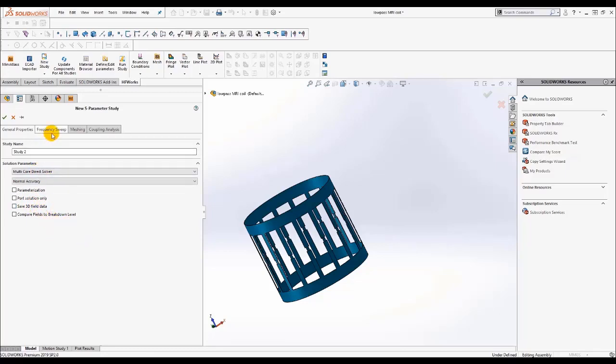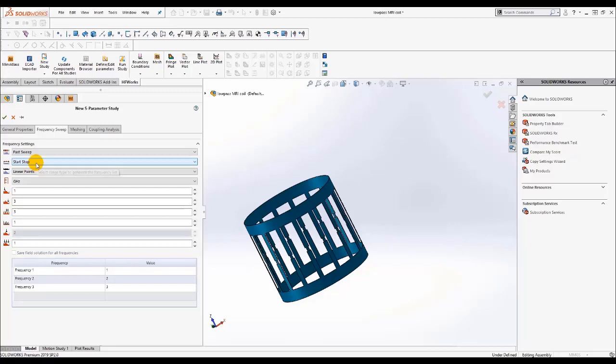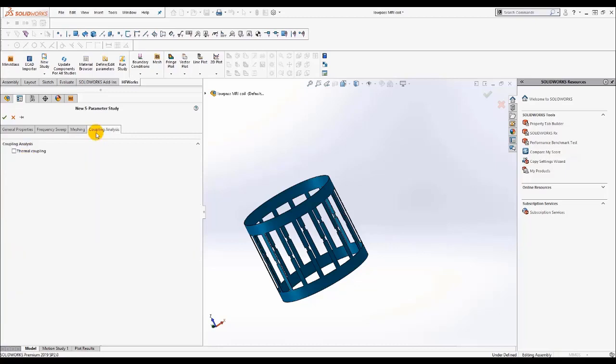Once we are done with this step, we move to the next step for frequency sweep. Actually here the default frequency setting is single point, but we can change it to fast sweep, discrete sweep, etc. We have to set the initial frequency, start frequency, end frequency, and number of frequencies. Once it is done, we can check the frequency list from this grid data. Next, we move to the meshing, from where we can choose the meshing type: manual meshing with user-defined mesh controls, or with adaptation, with many features here. Then we move to the last tab for coupling analysis.